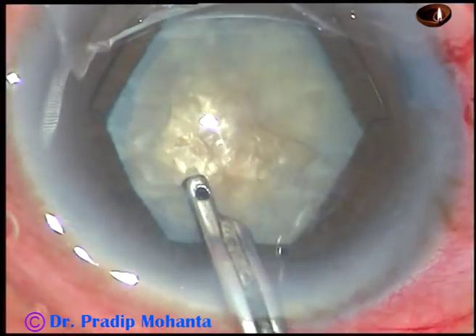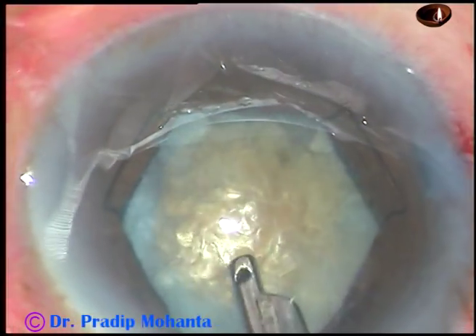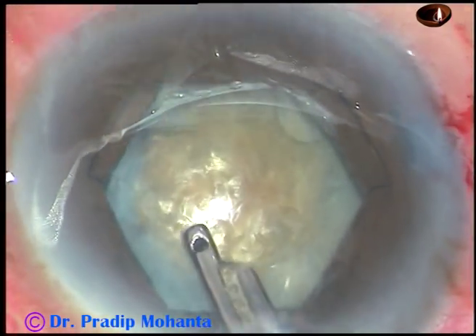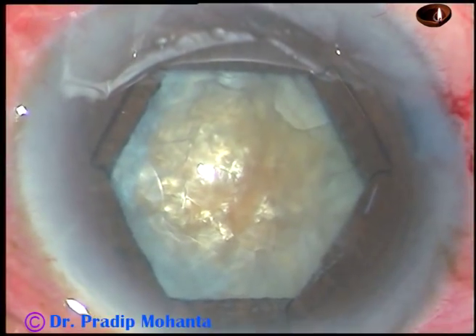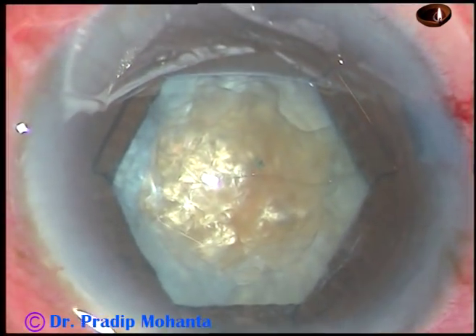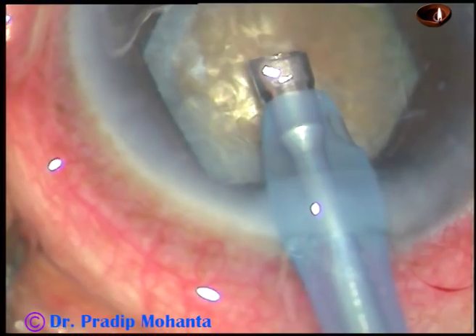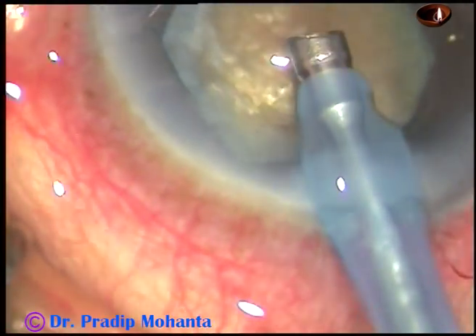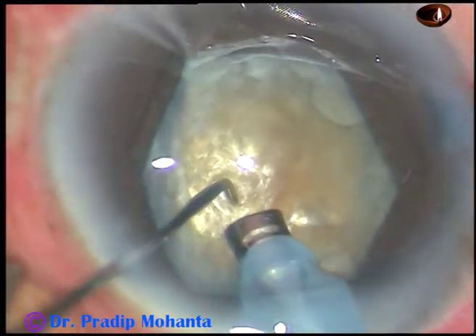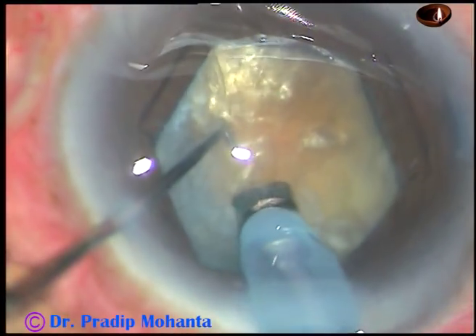I have cleaned some superficial cortical matter with Simcoe cannula, and now you can see the hard brown nucleus — nuclear sclerosis will be about grade 4 plus or grade 5 in this case. Viscoelastic substance is injected, and the tip of the phaco handpiece is introduced into the anterior chamber. As usual in such cases, I do direct chop, which I call submarine chop.